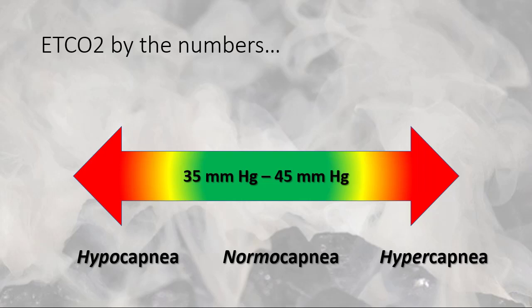Now, before this lecture, if you were just looking at the numbers by themselves, you might think that this was just simply a reference to how fast or how slow the patient was ventilating or you were ventilating for them.